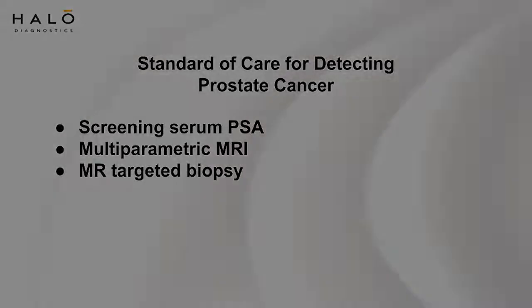of the prostate. In a subset of men who have clinically significant prostate cancer, confirmed with these standard of care detection techniques, they can go on to image-guided focal therapy. In our case, we do MRI-guided laser focal therapy.